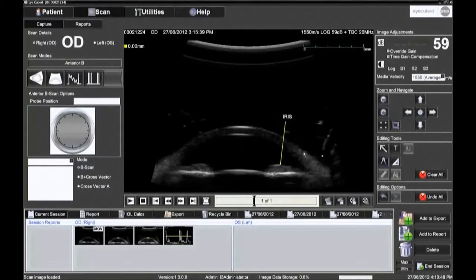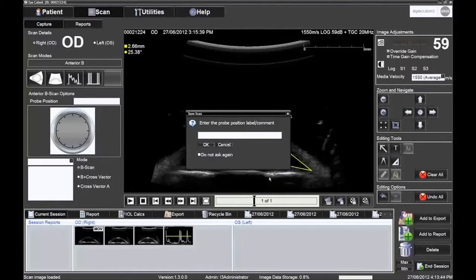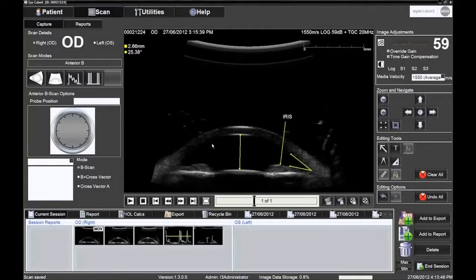It is possible to measure distances and angles on the frozen picture. To save an image, the operator simply clicks on the second pictogram in the bar at the bottom right of the screen. The position of the probe can be noted as a clock hour, either by clicking on the clock face — inside the face for a longitudinal exam, or outside the face for a transverse exam — or typed in manually.